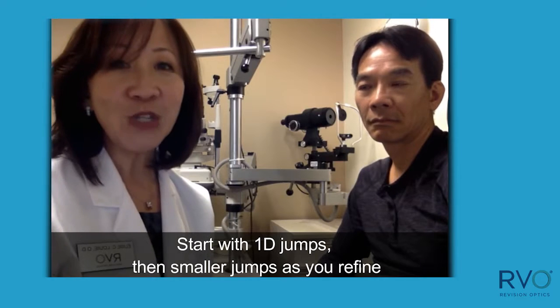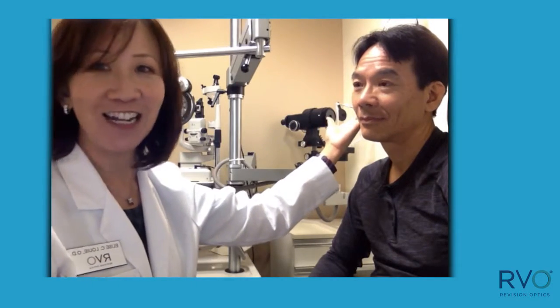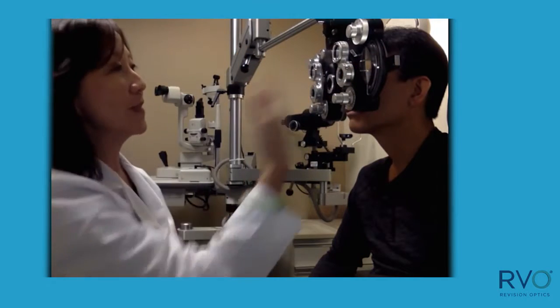Now I will demonstrate these techniques on this very handsome and very nice raindrop patient. The inlay is in the left eye, his non-dominant eye. So first I'm going to start with the dominant eye.